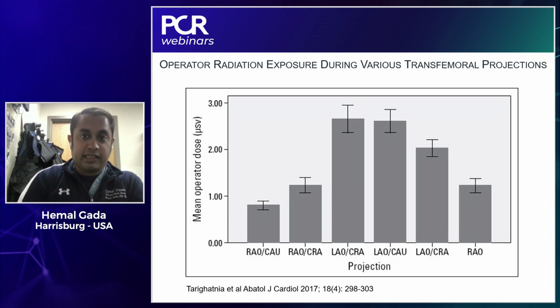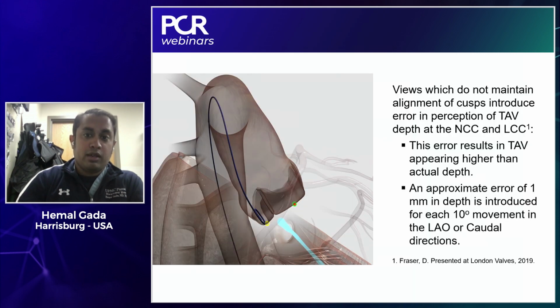Clearly, the point of this technique is to make it a more efficient and predictable deployment. Mohammed just did a deployment within the span of 15 minutes. And so something like that is going to basically obviate this discussion. But the point is that radiation exposure to the operator is less in the cusp overlap view generally.